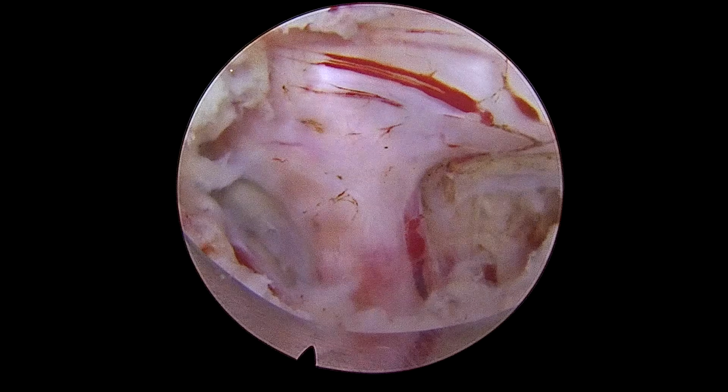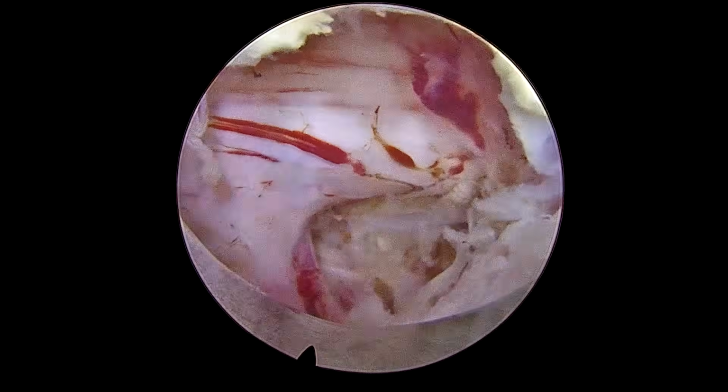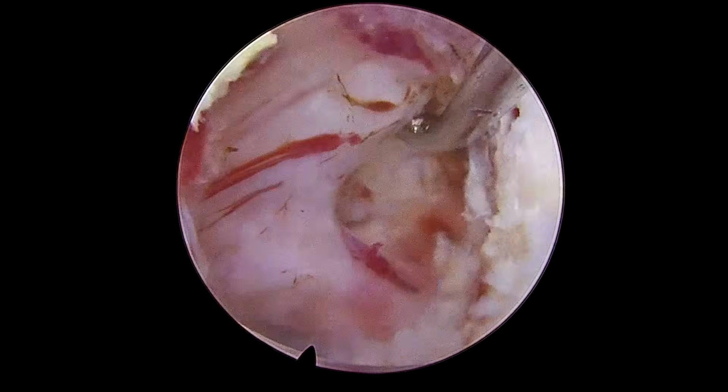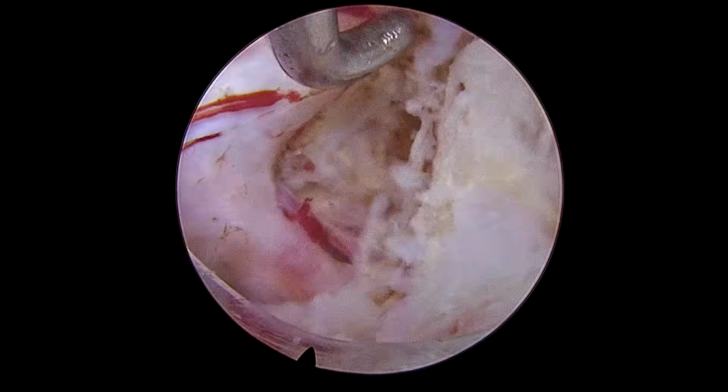Now you can see here the root is a bit shifted inferiorly, because there was a fragment in the axilla and the root was pushed superiorly. You can see here it is now more or less in the center. Yes, this is the annular tear here. So no fragment, no migrated fragment. I am searching for any migrated fragment, but there is none.